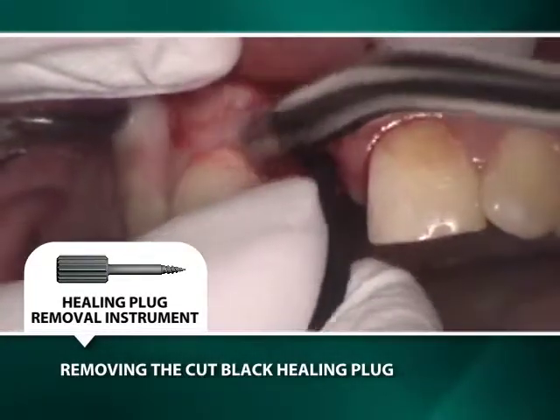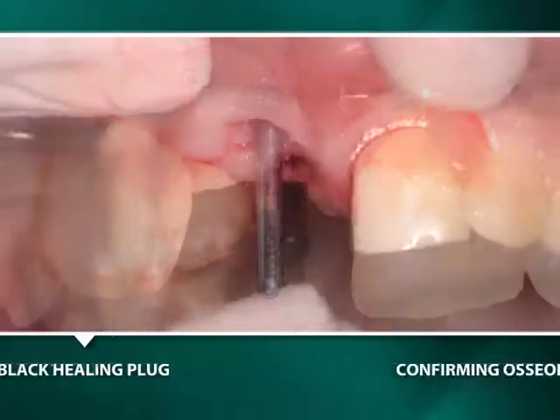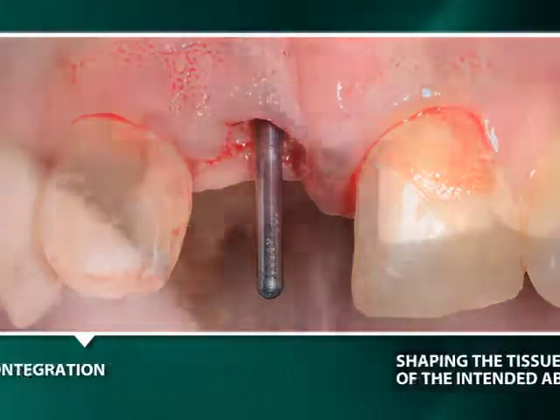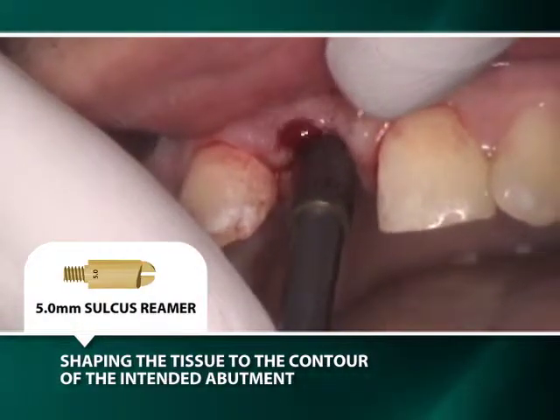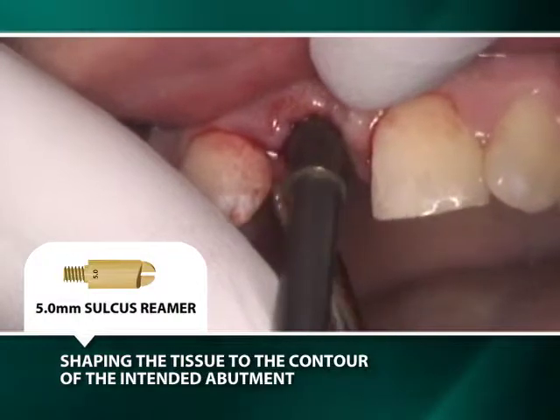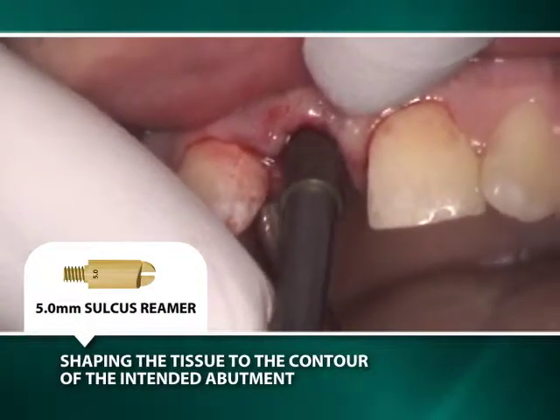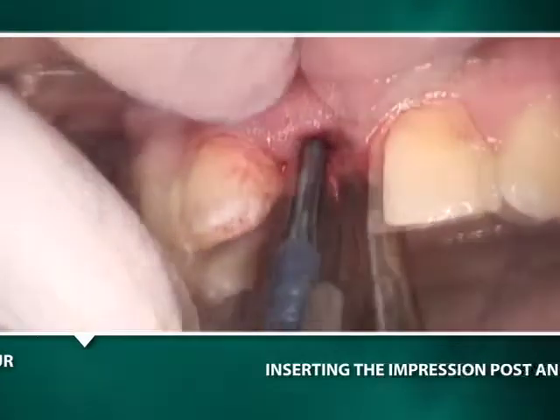A blue 2.5mm wide guide pin is inserted into the well of the implant to check for integration. A 5mm sulcus reamer attached to a threaded straight driver is placed onto the guide pin and rotated to shape the tissues to conform to the hemispherical base of the 5mm diameter of the intended permanent abutment.